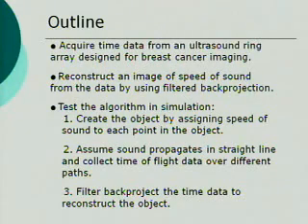I acquired time data from an ultrasound ring array designed for breast cancer imaging. I reconstruct an image of speed of sound from the data by using filtered backprojection. And before all that, I need to test the algorithm in simulation. So I first create the object by assigning speed of sound to each point in the object. I assume sound propagates in a straight line and collect time of flight data over different paths. Then I filter backproject the time data to reconstruct the object.